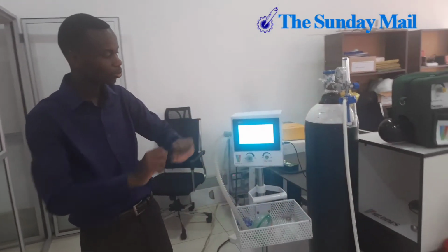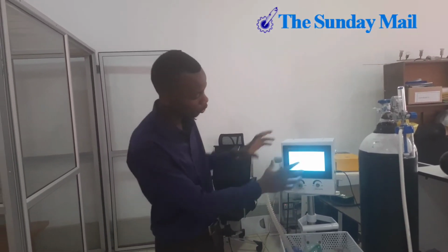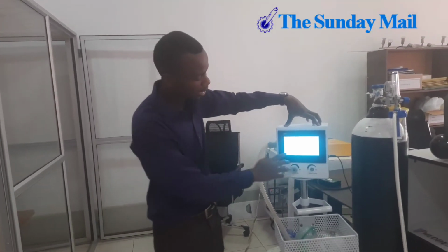Then we also have our work towards the hospital type ventilator, or the ICU ventilator. With those, you can pay attention to various parameters, but not all of them. For instance, with the heat vent 270, the in-hospital one, we are paying attention to pressure and FiO2, which is the fraction of inspired oxygen, the amount of oxygen in the air you are delivering to the patient. With this one, you can set the highs and lows for these two parameters. During functionality, as you can hear, there's a small alarm going on, because I have set the minimum FiO2 level. At the moment, because this is at room air, the reading is 21%, but my set value was higher, and hence this alarm is confirming that the ventilator is not giving exactly what you set.